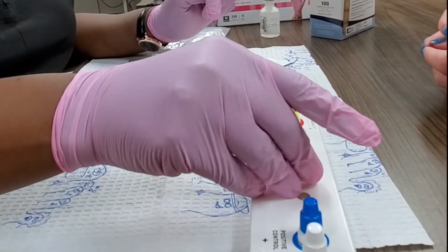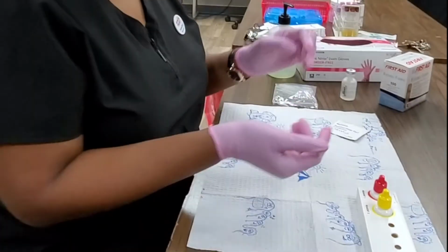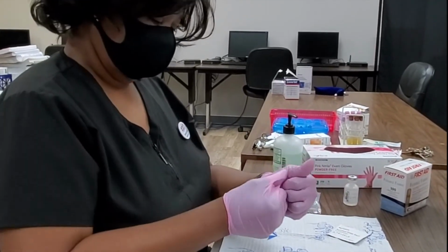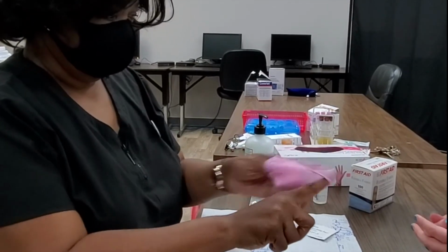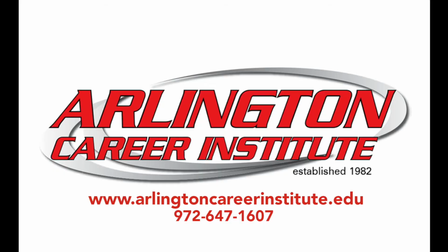So we can go ahead and discard that in the biohazard container and the tube, and then remove your gloves. And that concludes the Strep A test.